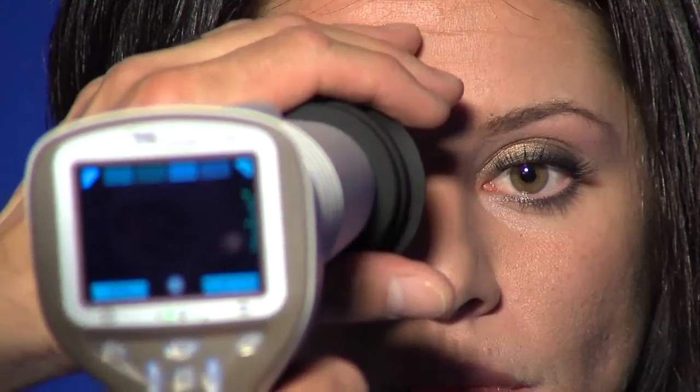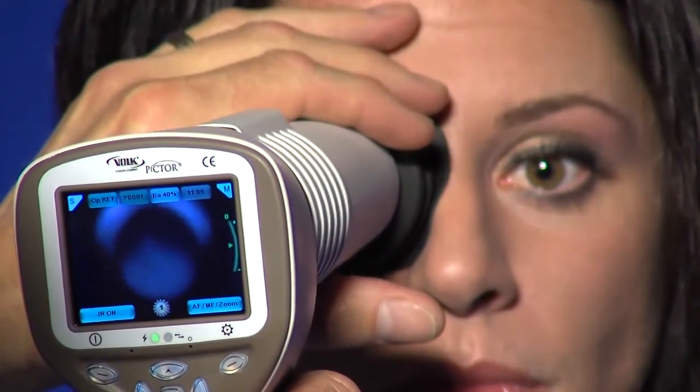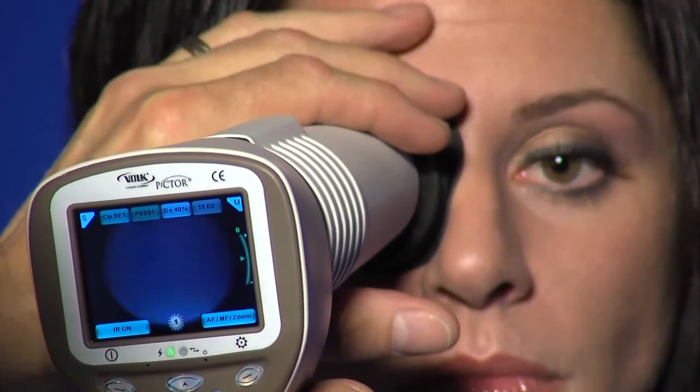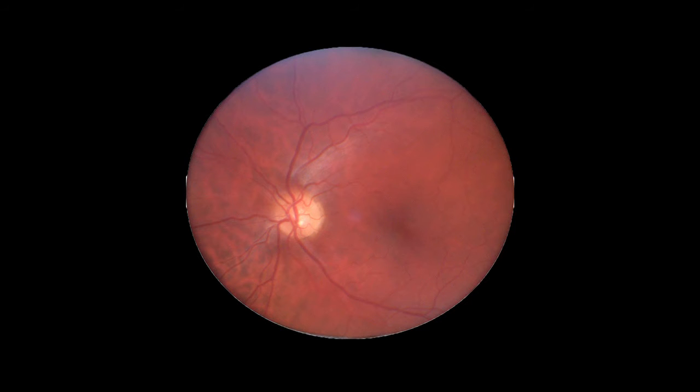Approach the eye starting from about a 4 inch distance. Keep the pupil in the center of the screen. Continue to approach until you can visualize a grayscale image of the retina on the LCD screen. Still image is captured by pressing the shutter key all the way down.